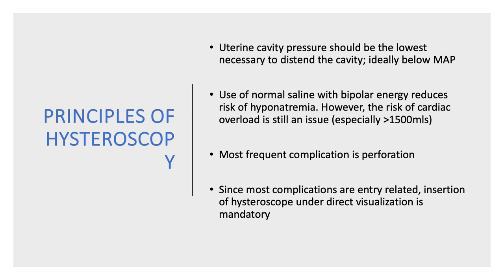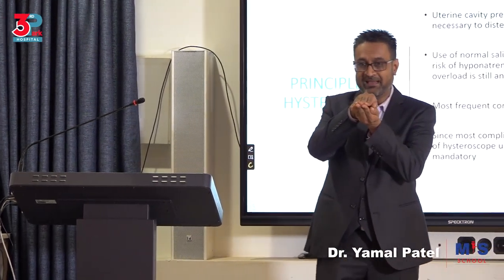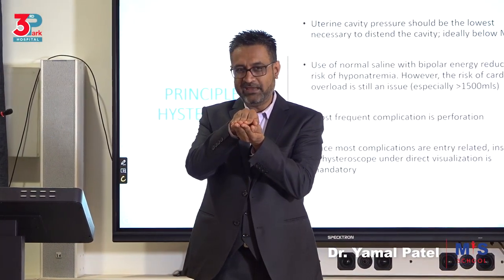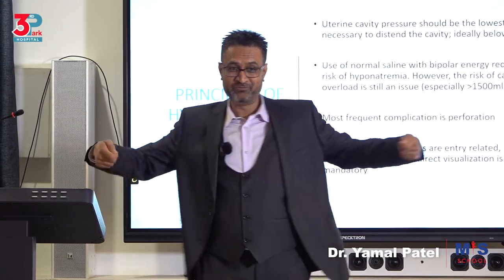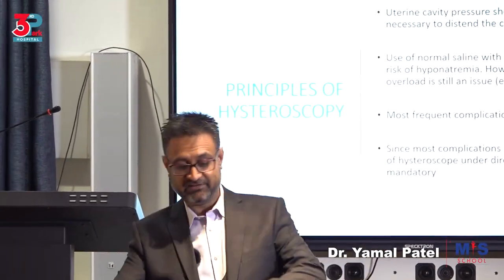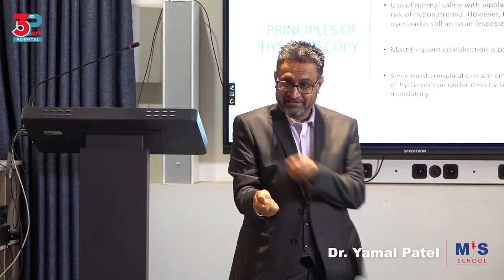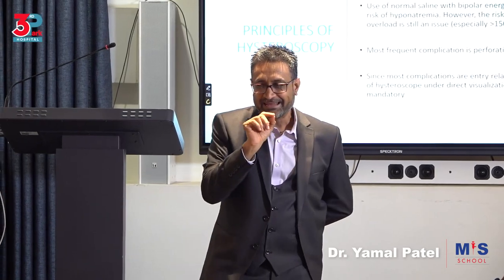So principles, remember, hysteroscopy is done in a very narrow cavity. And a very small cavity, and it's a one-man show. One-man show means you're the only surgeon, you're the only assistant, you don't have two people holding things for you. And it's a one-handed surgery. So what I mean is normally, we do surgery, traction, counter-traction, cut, pull, stretch, cut. That's what we do, right? In hysteroscopy, it's like one hand is just holding the view, but one is cutting, cut, cut. You get what I'm saying? So it's a bit tricky.